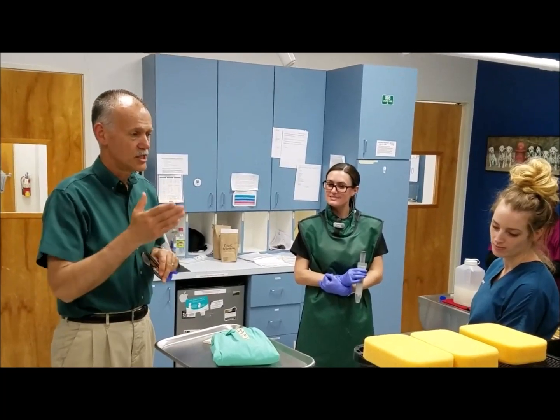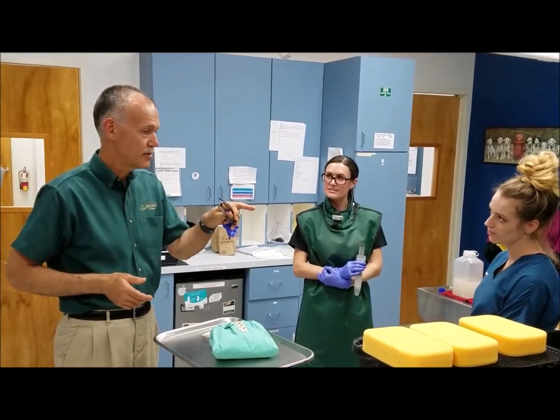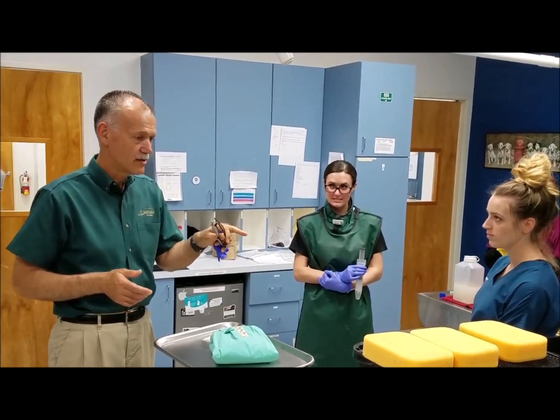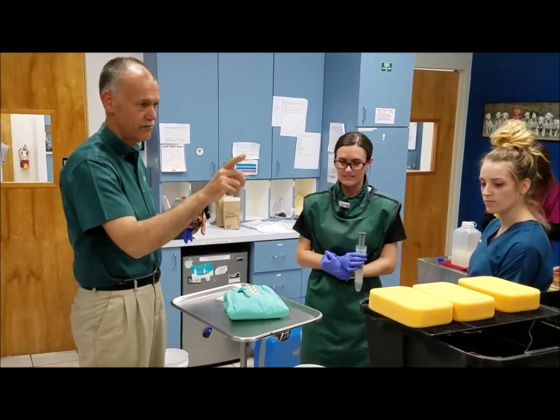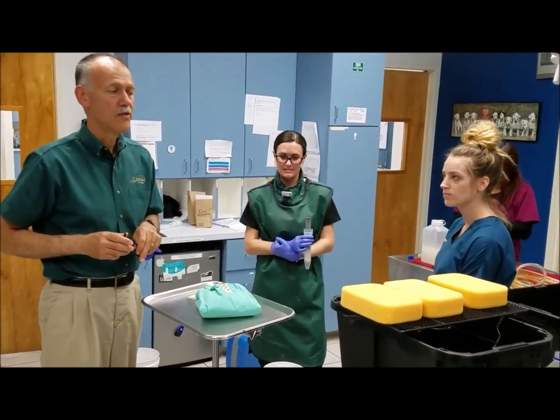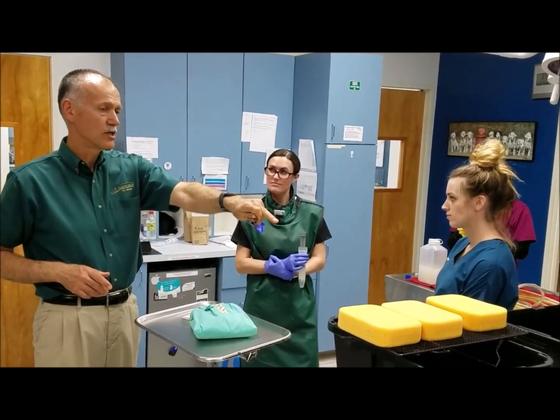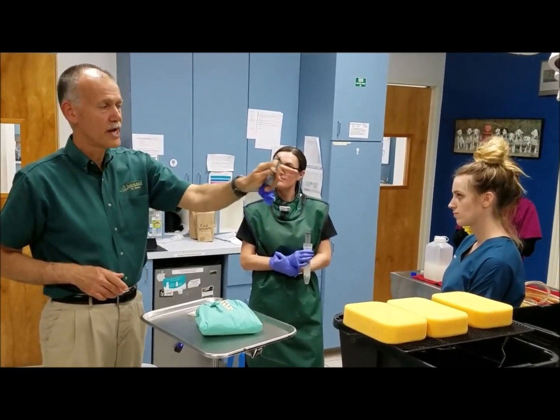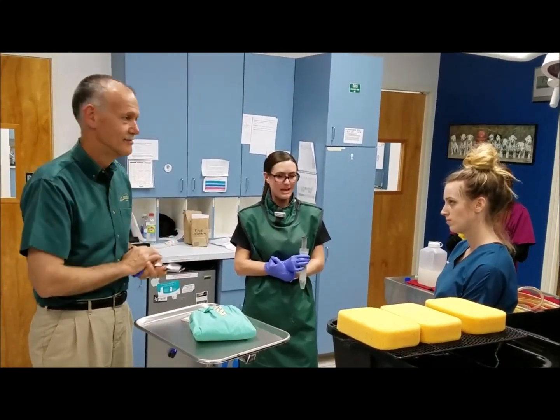And then when the procedure's done, again if he's doing well, we're going to transfer him to radiology, keeping him anesthetized by moving our surgical suite on top of the tray so that we can get a film. And then he's going to go back in the aquarium here to recover before he eventually goes back in his transfer tank to go back home where he came from. That's the plan.